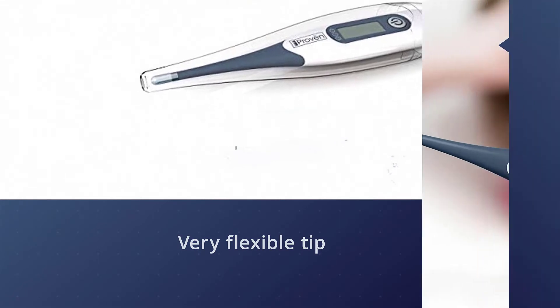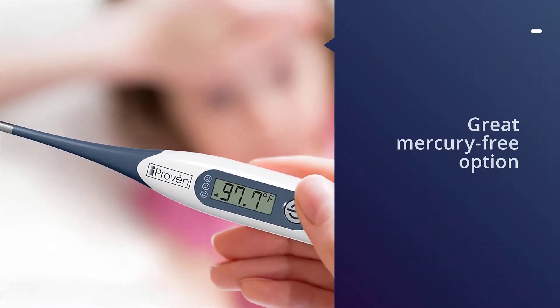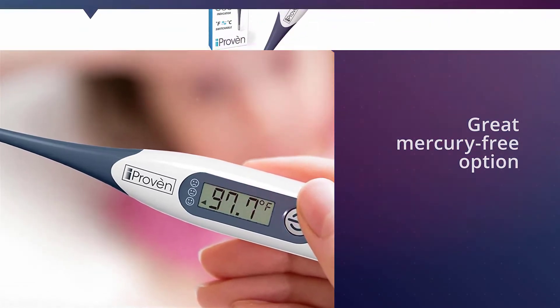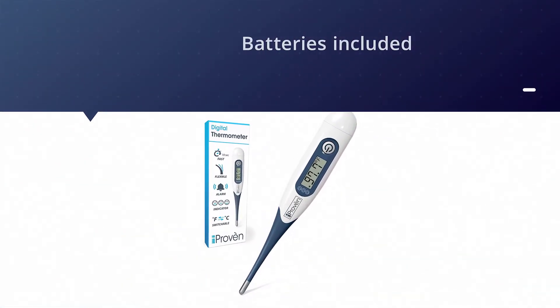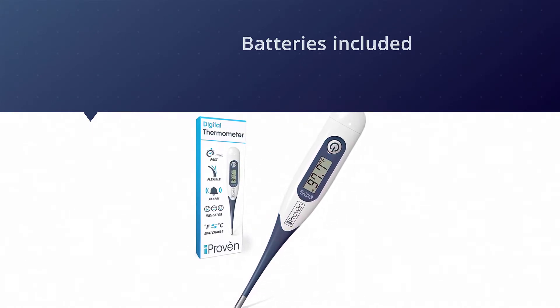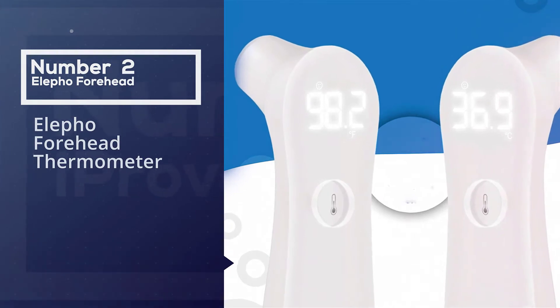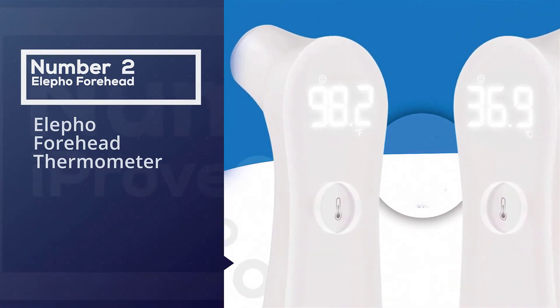This durable thermometer is also waterproof, making it super easy to clean with just a little water and soap. Like the other options on this list, this thermometer is a great mercury-free option. Number two: the Elepho forehead thermometer.